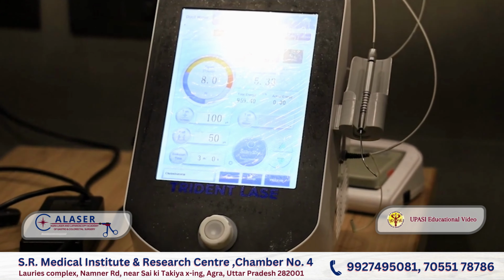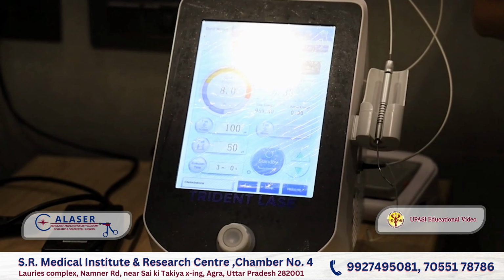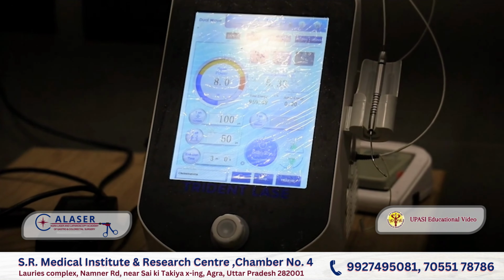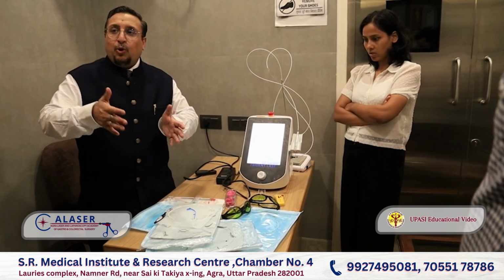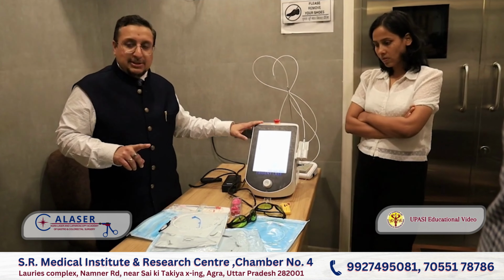I told you for 980 it is mainly for piles and fissures. But if you want to do fistula, pilonidal sinus, EVLA, varicose vein, then you need basically a 1470 machine, because I told you why. The depth of penetration and the lateral spread is only 1 to 2 millimeter, as 1470 is absorbed 40 times more than the 980 in water. The chromophore for 1470 is water. That is why the 1470 machine is used.